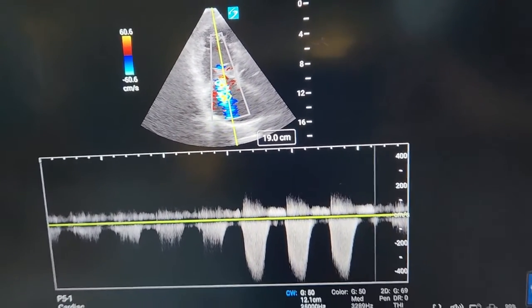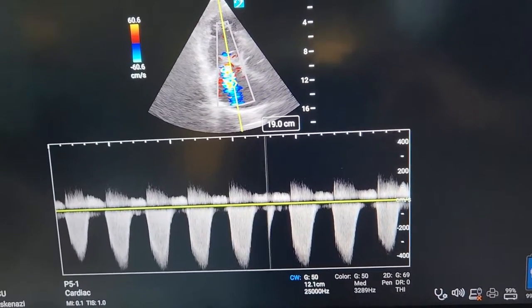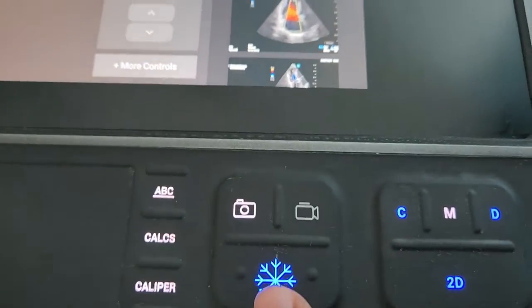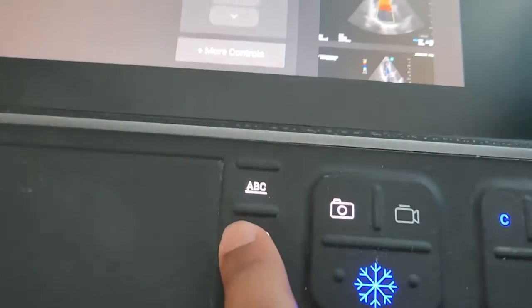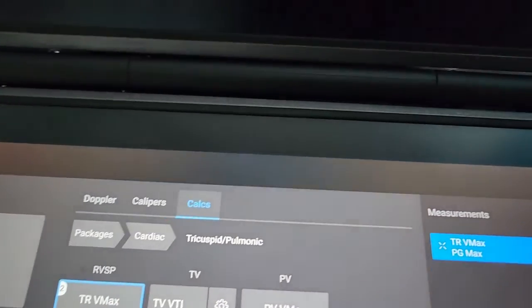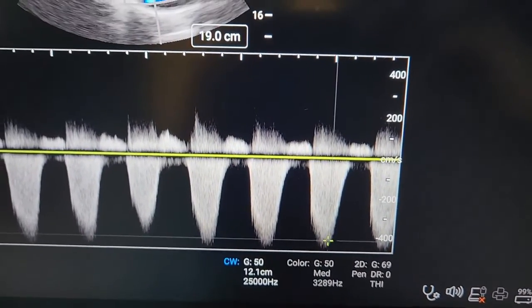There we go. So our Doppler baseline is low now. We're going to freeze, go to calculations, TR max, and we want to measure the greatest, which we'll say is this one.